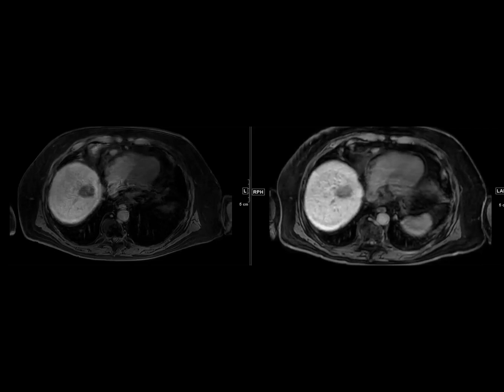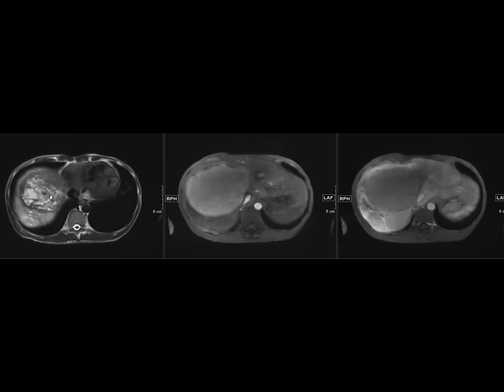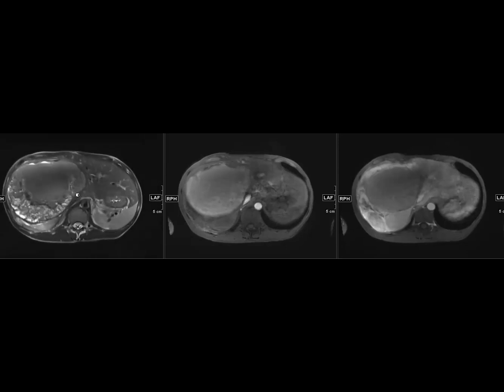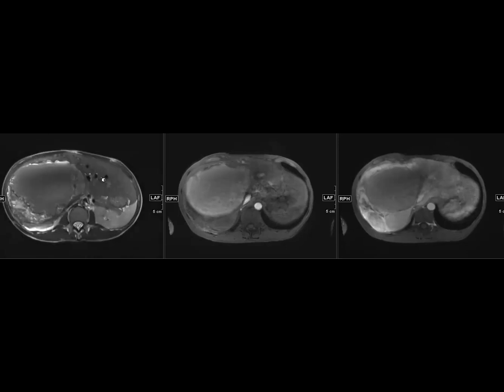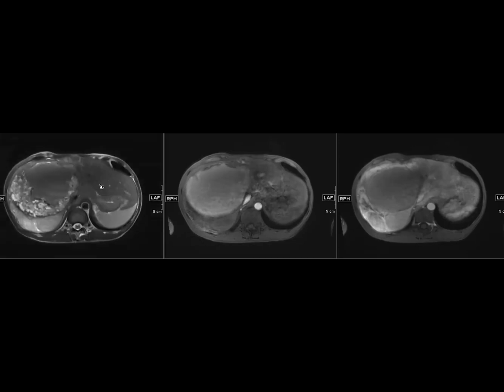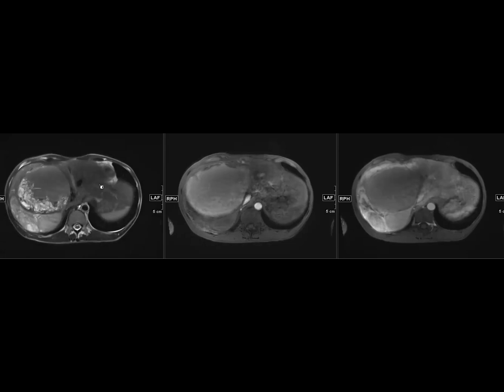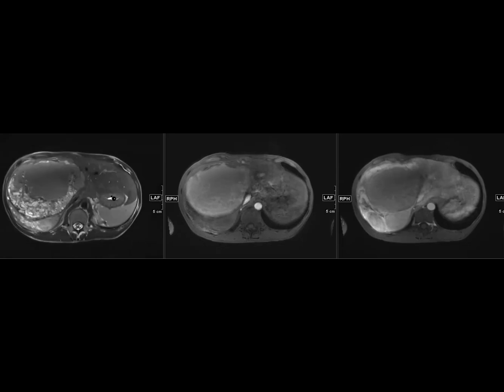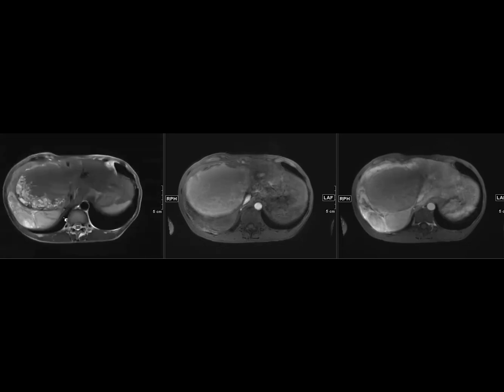All right, the next interesting case is a young man. He's 40, and he's an alcoholic, but doesn't have known cirrhosis. He went for a routine physical to a primary care physician who examined him and assessed that the patient had quite a big liver. So the physician assessed hepatomegaly and sent the patient for an ultrasound, which I don't have, as this was an outside institution. Then, based on the ultrasound, the patient had an MR.